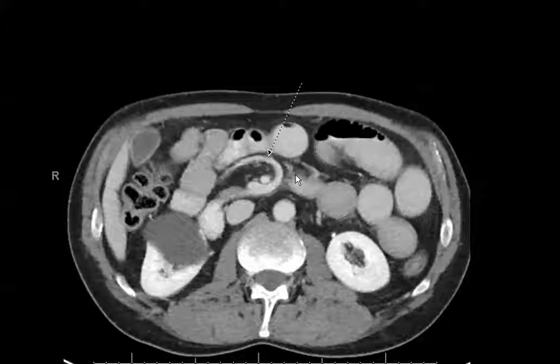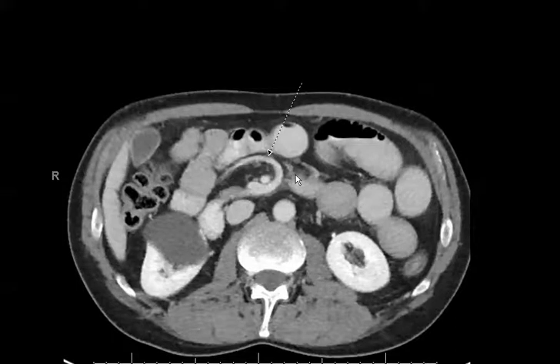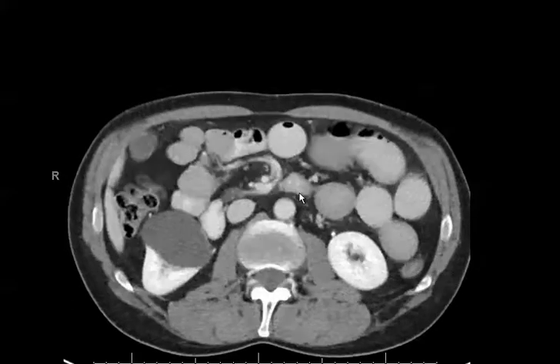A midgut volvulus represents twisting of the bowel loops around the superior mesenteric vessels or the mesentery. This can result in bowel ischemia and bowel necrosis, which is why this is an important diagnosis to make — this is a surgical emergency. This patient was taken to surgery to relieve the volvulus and to hopefully reduce the risk of bowel ischemia and bowel necrosis.